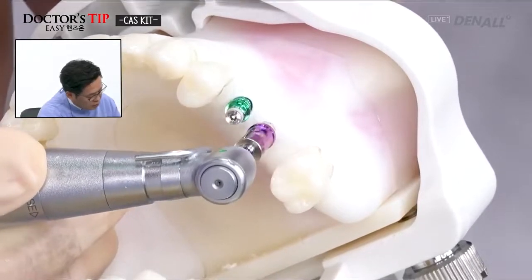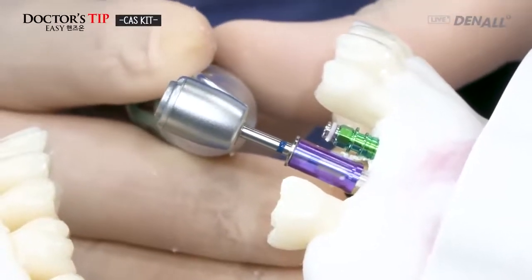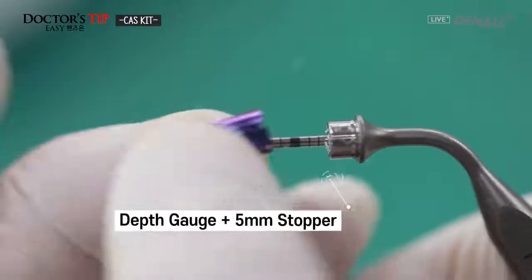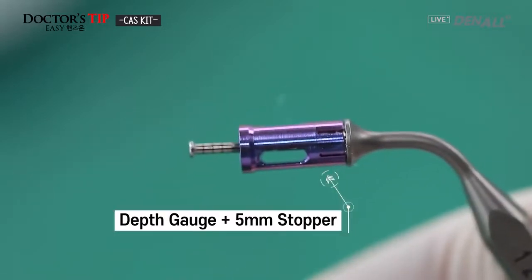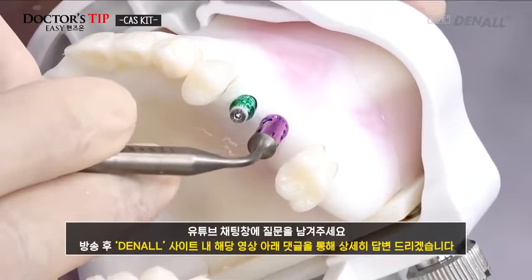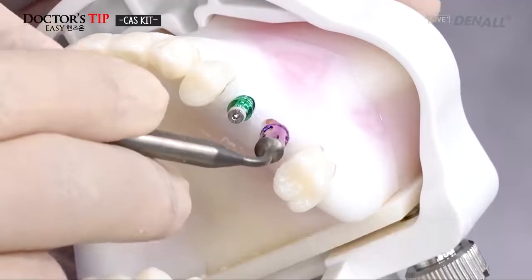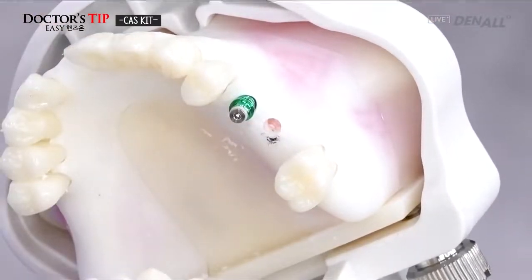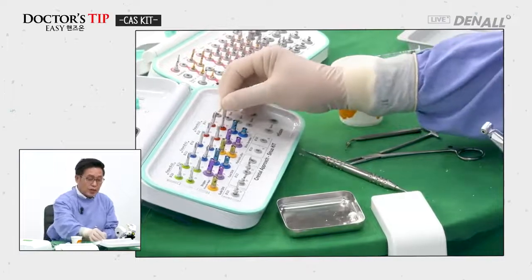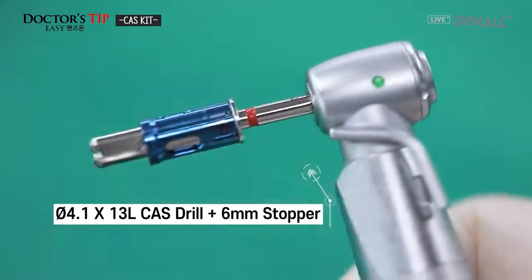Using the CAS drill, now the 5 millimeter stopper is connected to the depth gauge to check whether the sinus floor is penetrated. Part of it is penetrated. It's not completely penetrated. So let's advance a little bit more. A 5.0 fixture is to be installed. So the 4.1 CAS drill is to be used with the 6 millimeter stopper for the drilling.